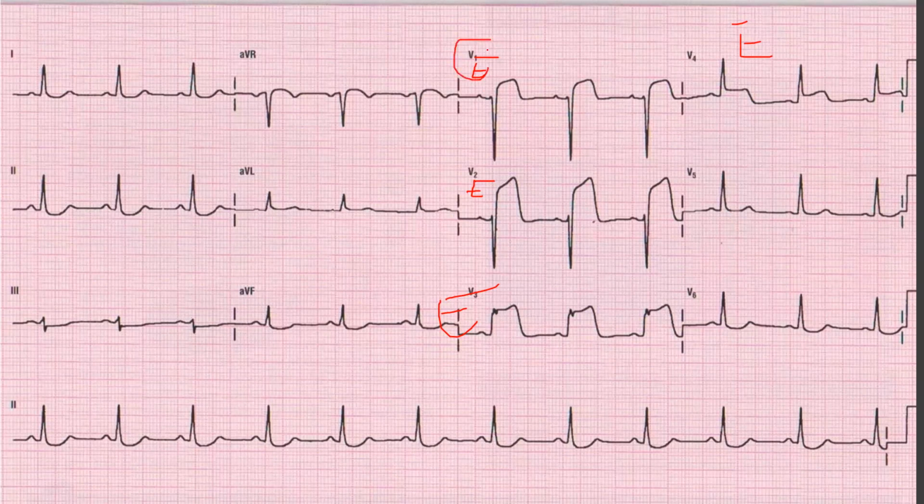So our infarcted areas are your septum, septal infarction, V3 and V4, your anterior. So we have an anteroseptal MI. Okay, anterior and septal. There was no inferior. There was no lateral wall infarction. Let's take another one.